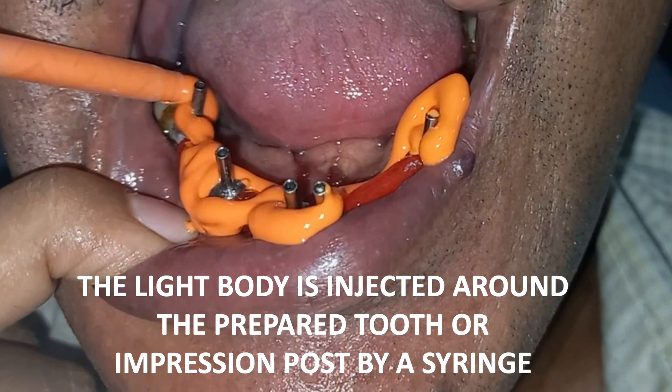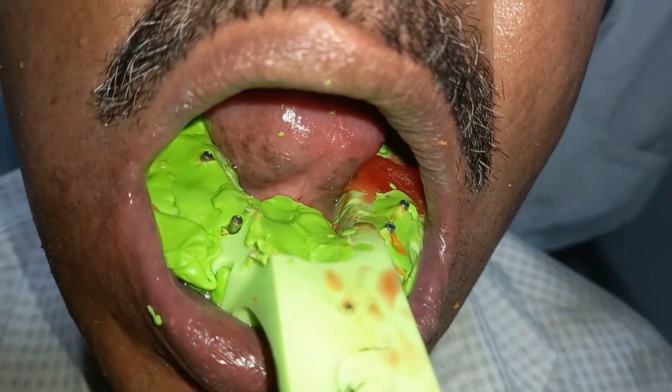Sorry for not using gloves — whenever you are going to take an impression, do use gloves and maintain hygiene. After loading the light body on the tray and injecting it around the tooth, position the loaded tray in the mouth and take the impression.